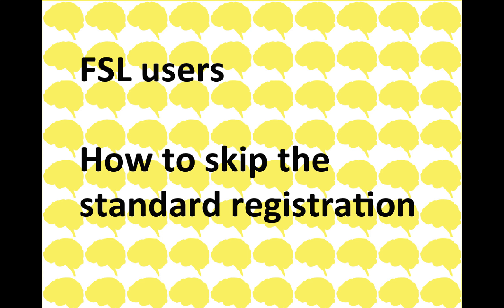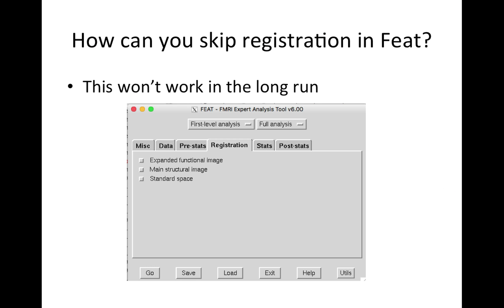They want to use those image registration algorithms as opposed to FSL's FLIRT and FNIRT combination. If you've ever tried to do this in FSL — skipping FSL's registration — you typically run into problems. Your first try might be to simply turn off the registration in the GUI when running your first level analysis, and this will run the first level analysis, but the problem occurs at the higher level analysis — it will stop.